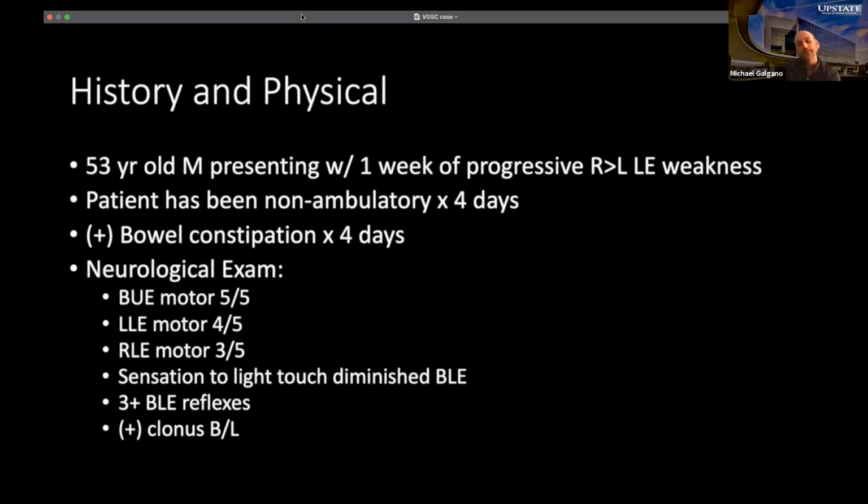Any thoughts on that? Yeah, maybe, and I also thought, should I have gone to the pelvis to start with? I was taking away, I think part of the problem, you saw I added another rod there. I think part of the problem that I did not anticipate, and encountered late in the day, is once I cut away all that bone, the pedicles in that bone, her spine really flattened out, and I had trouble getting it where I wanted it. And I don't think I anticipated that well, for sure.